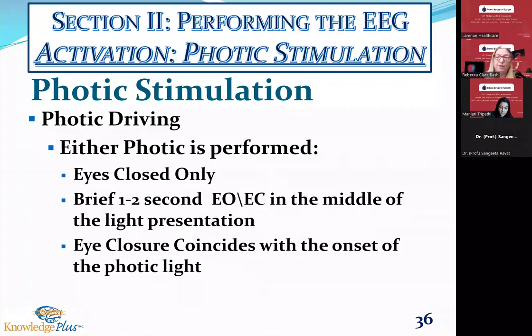Eye closure, the very last philosophy of the best way to do this is when the light stops, let's say it stops at 3 per second, you say, open your eyes, Helen. And the minute you start at 6 hertz, you have them close their eyes. So that's eye closure coinciding with the onset of the photic light. Again, all of these are represented in the peer-reviewed literature. I've always been of the school that eye opening and eye closure in the middle of the light presentation has a higher yield.